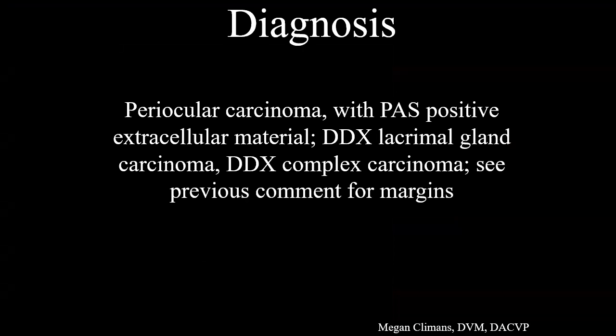We did not. I know we just did a pancytokeratin. We're just trying to be economical. Oh, the question was, did we not do a Vimentin? We didn't. If we had done that, it would have helped us to see whether the spindle cells also expressed Vimentin. If they're expressing both pancytokeratin and Vimentin, that would have helped us zero in on who the spindle cells were.